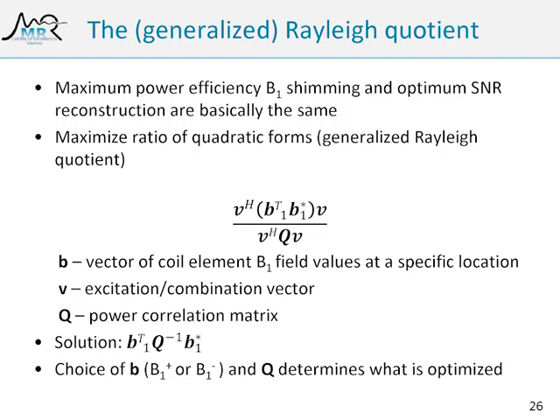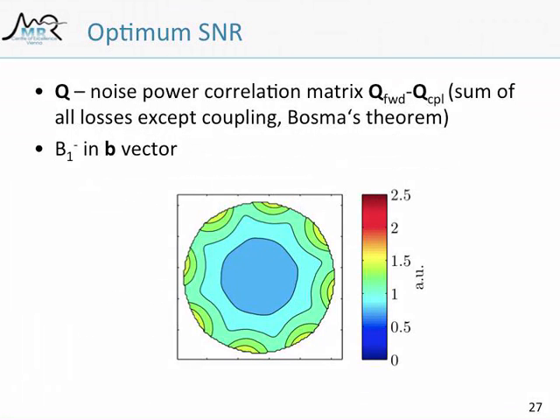We've got the inverse of this matrix there, and that's basically the sum of squares reconstruction that everyone does. And this is the inverse noise correlation matrix. Now, but how do we put that to use in the simulation? Okay, and how we put it to use in the simulation is how we choose which matrix Q we choose here. We've got all those power correlation matrices.